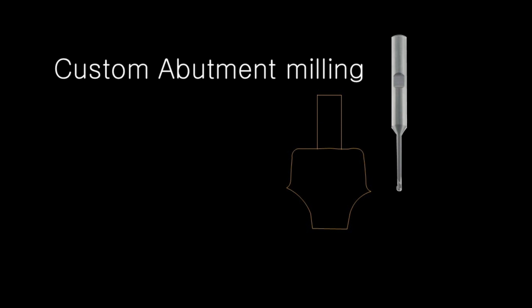And that's because this shaft changes over time. So this is the problem of discrepancy between the designed abutment and the actual product that we get. And a lot of times we end up with an abutment that is larger in size than the designed abutment.